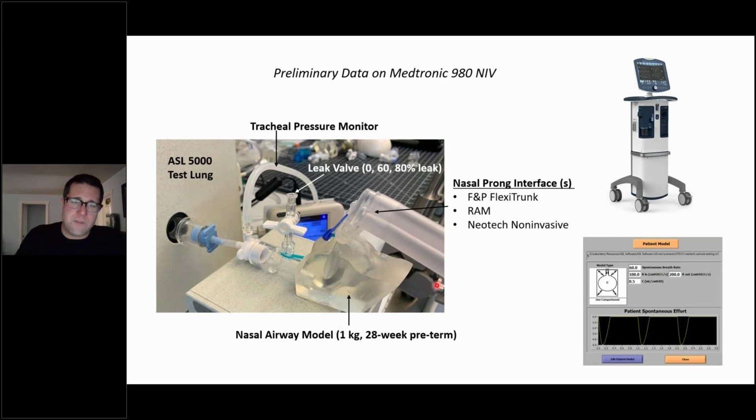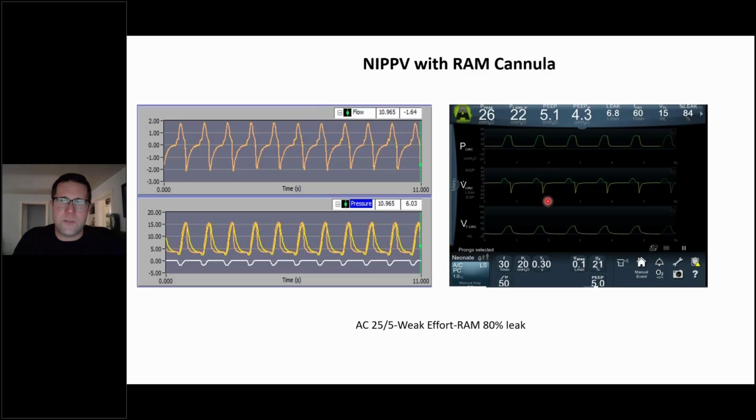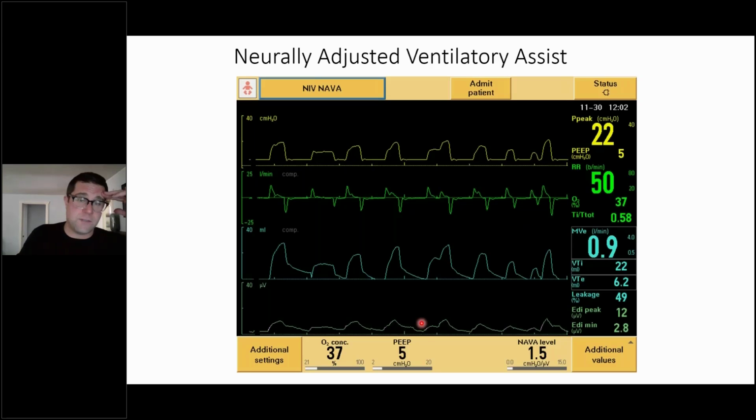There are a number of other ventilators that are available now that don't require the use of a proximal flow sensor necessarily for non-invasive ventilation, and are able to calculate the leak and correct for that and take into account the circuit compliance factor to allow for synchronized breathing based on the flow measured back at the ventilator expiratory valve. And so people have come a long ways with non-invasive support.